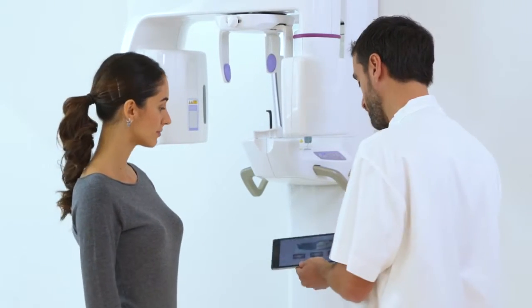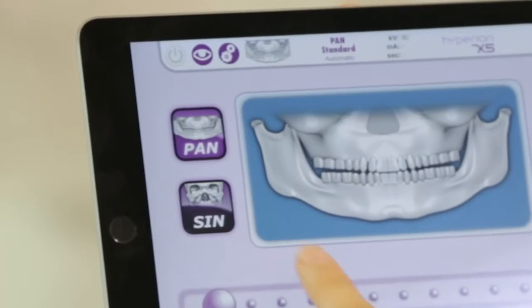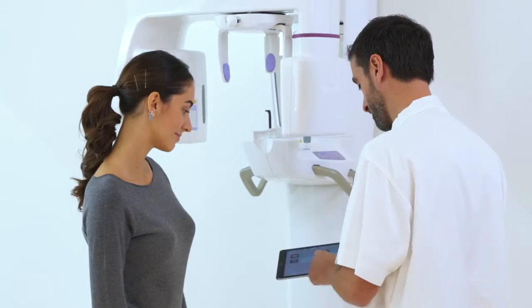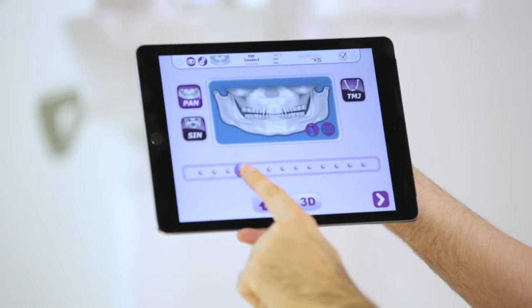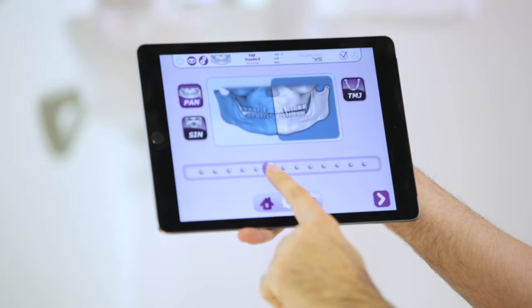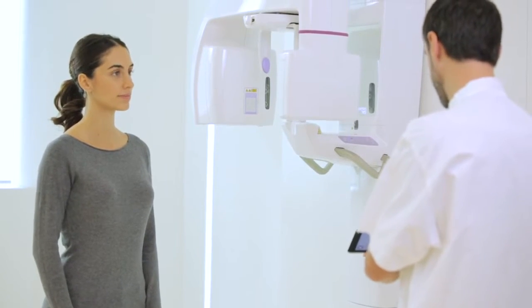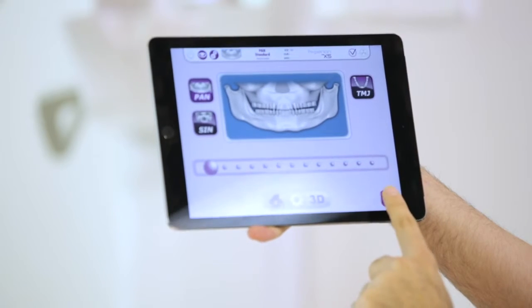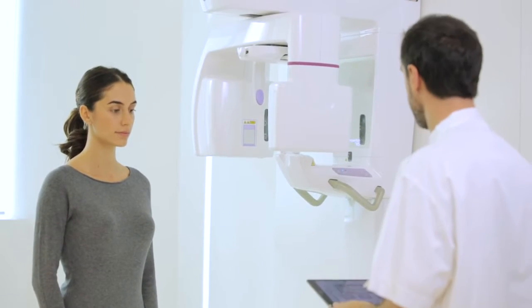To obtain panoramic imaging, the dentist selects PAN from the projection icons displayed on the iPad. Then, scrolling through the function bar, he can select one of the 9 types of projection. Once the desired examination has been selected, the patient must be positioned. First of all, press the key and wait for the X-ray unit to reach the initial position.